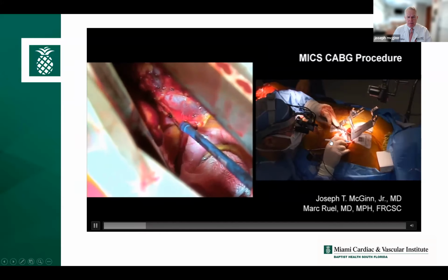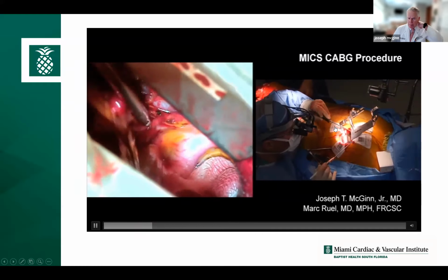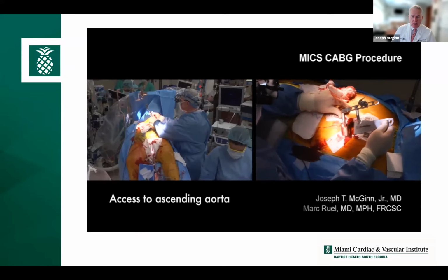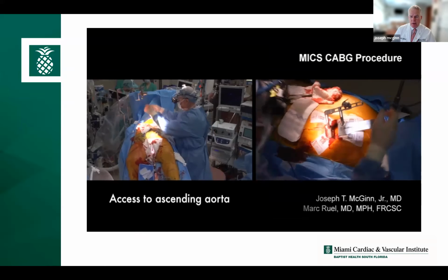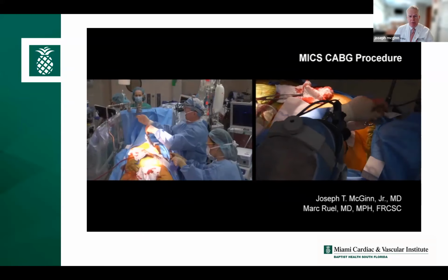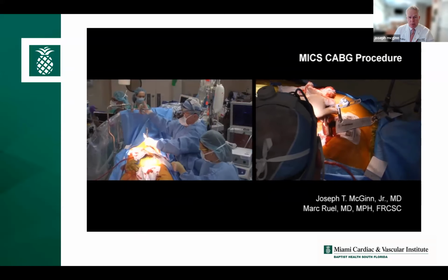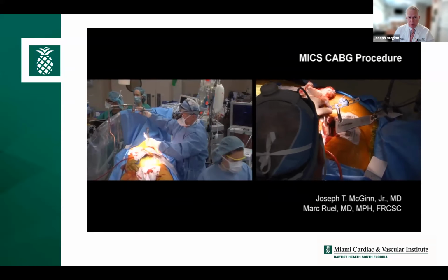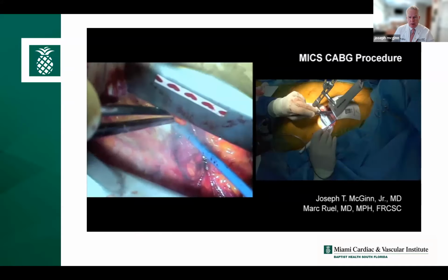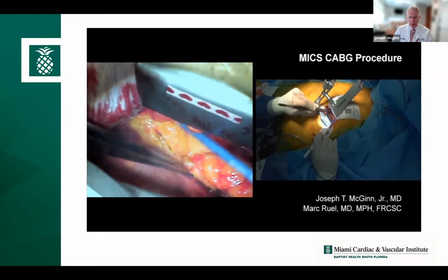And you can see I'm harvesting the internal mammary artery. That's one of the arteries we use for the main bypass. We also use arteries from the wrist and arteries also from the right side. That was the left artery. We also have a right artery. On a rare occasion, we'll use veins from the leg. We try not to use the veins from the leg because, number one, they don't last as long as the arteries. And number two, they frequently have a tough time healing. Patients really complain a lot about the leg harvesting.